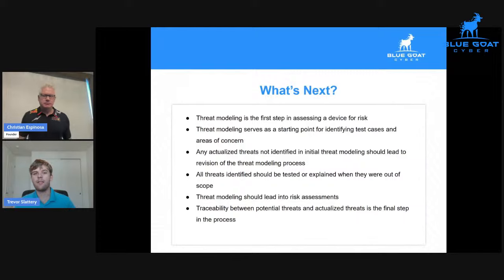Now, for the 10 threats that we are able to realize, we're able to perform these exploits and identify a vulnerability in the system. What is the impact? It could be fairly insignificant, such as just a banner on a web server that is showing the version of Nginx that's used. As long as that's a secure version of Nginx, it's not really a ton of helpful information. Well, of course, that is still not best practice to have information like that disclosed. From a patient harm perspective, from a patient data safety perspective, it's not going to be top of the problem.